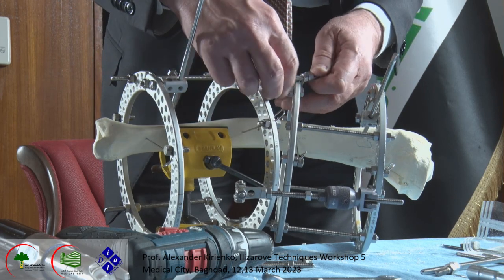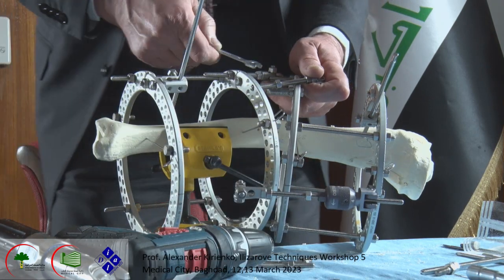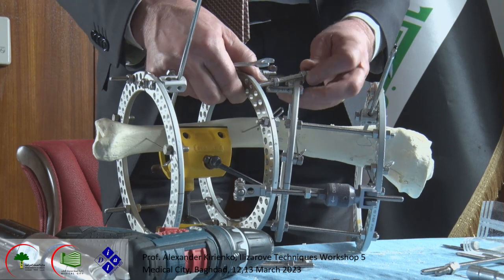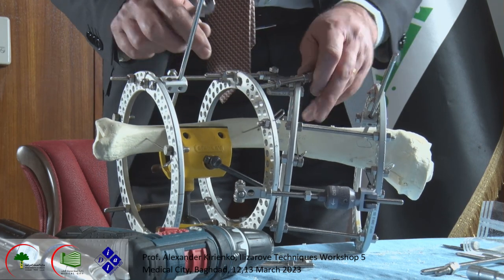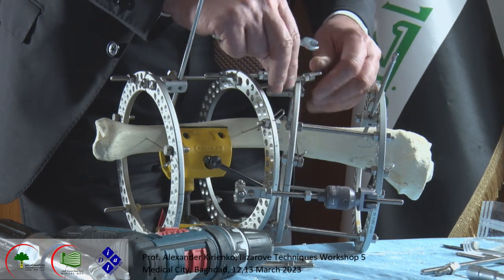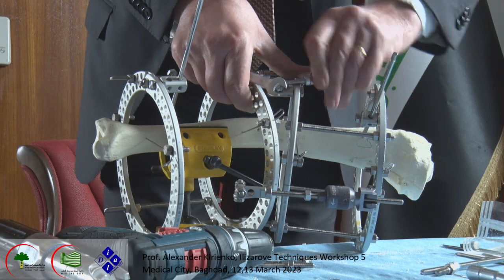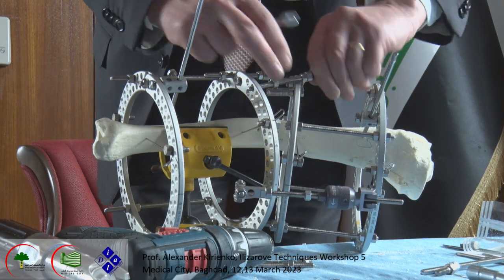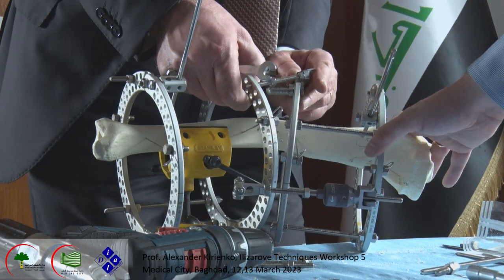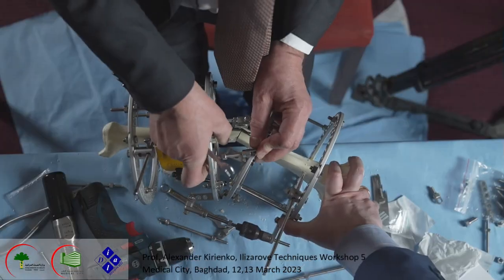You see, I can't go inside, and it creates a big problem to mount it, okay? But I show you these difficulties. Okay, it goes with difficulties.